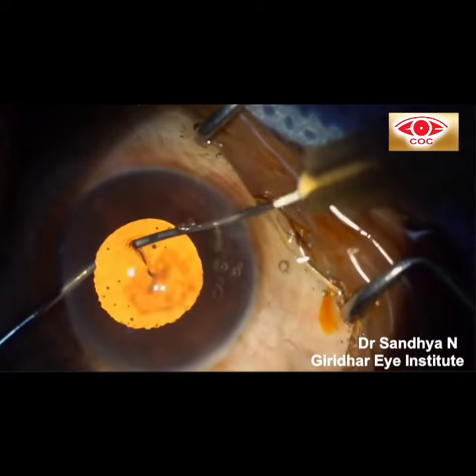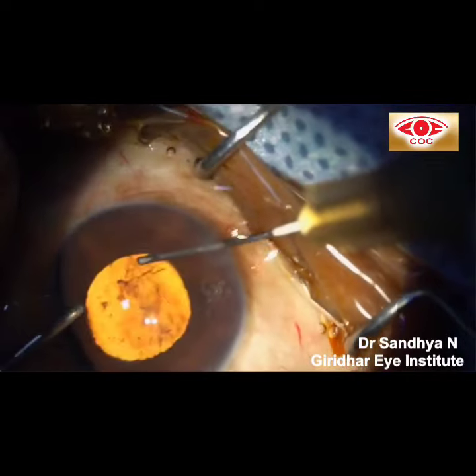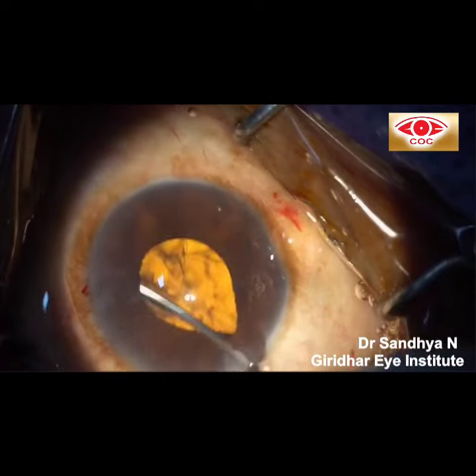Capsulorhexis was done under dispersive OVD. Care should be taken not to overinflate the anterior chamber, which can trigger iris prolapse. Side ports and clear corneal incision should have a long intracorneal tunnel to reduce the incidence of iris prolapse.